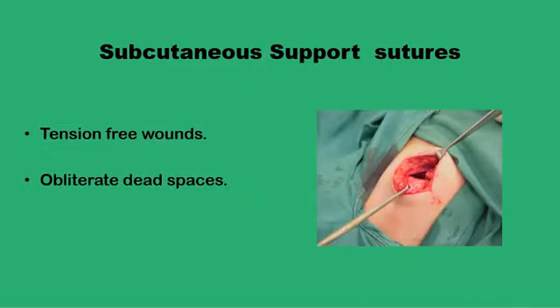And of course, a good closure of the subcutaneous tissue to provide a good support and a tension-free wound and obliterate all dead spaces are required before all these continuous sutures, particularly the intradermal subcuticular type of suture.